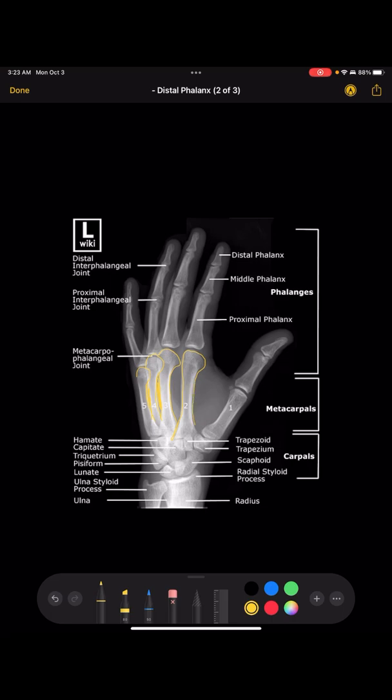Additionally, the 2nd metacarpal should be clearly separated from the 3rd metacarpal — that's how you confirm you've got the perfect oblique angle.